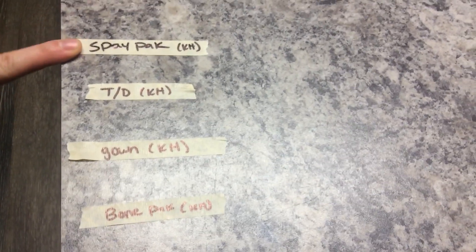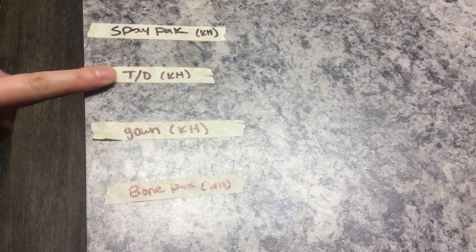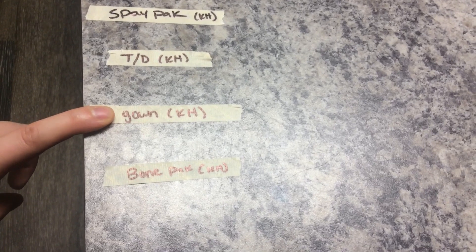These are the different packs that we have. This one is the spay pack — that's the label that goes on the spay pack. This is the label for towel and drape. This is the label for a gown if you wrap a gown.